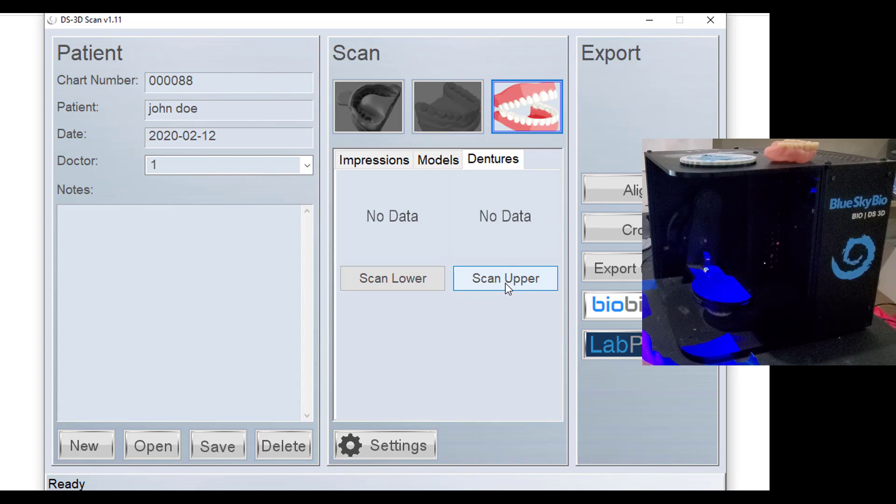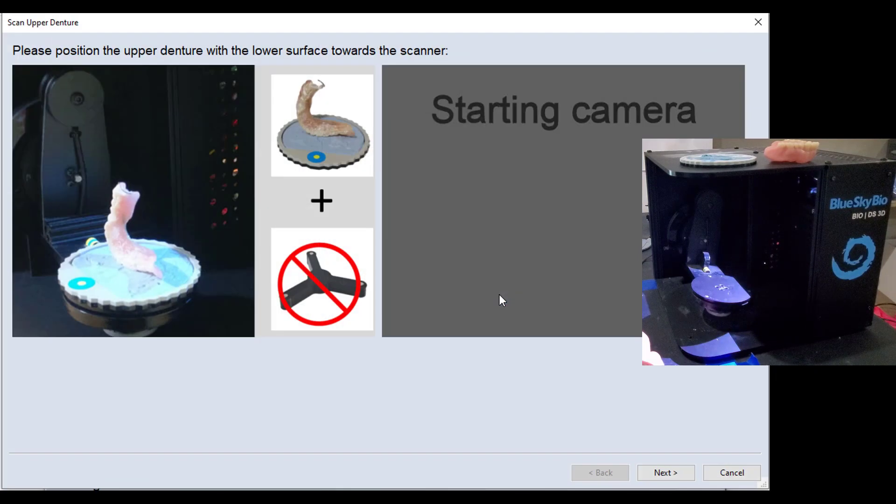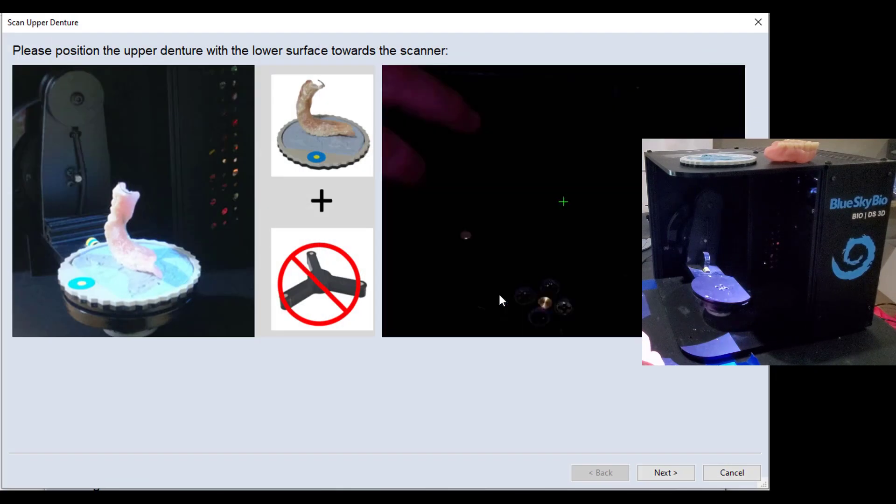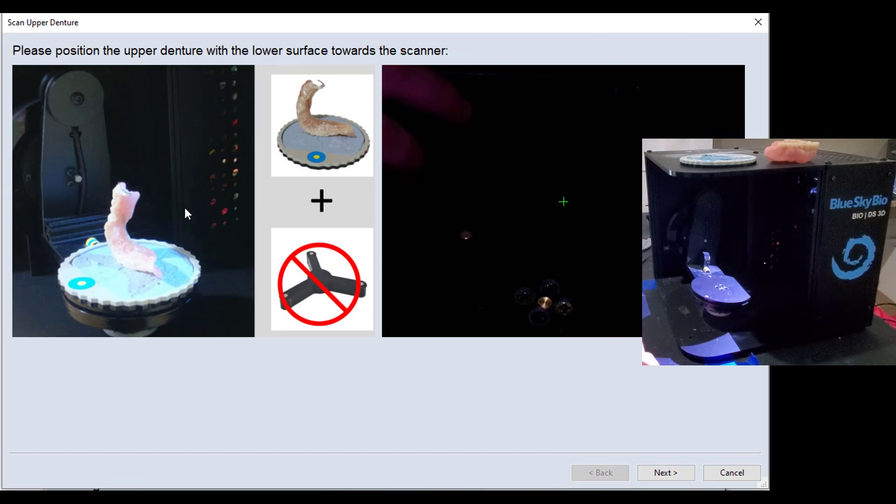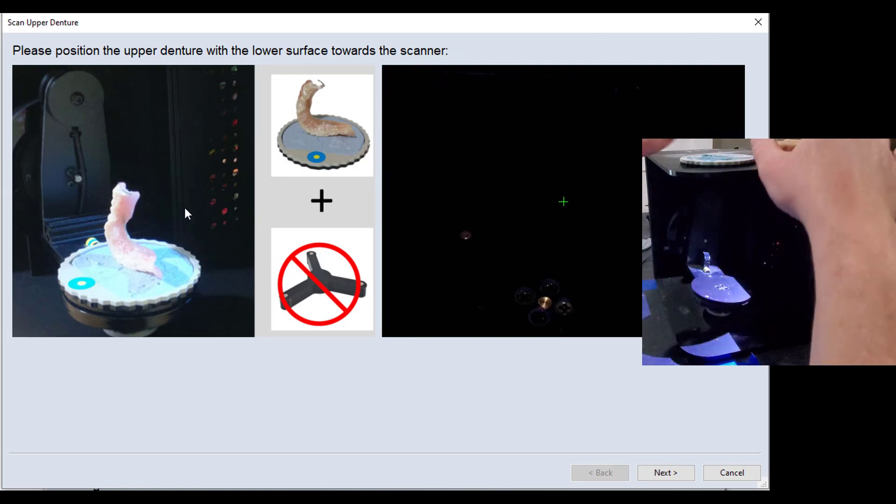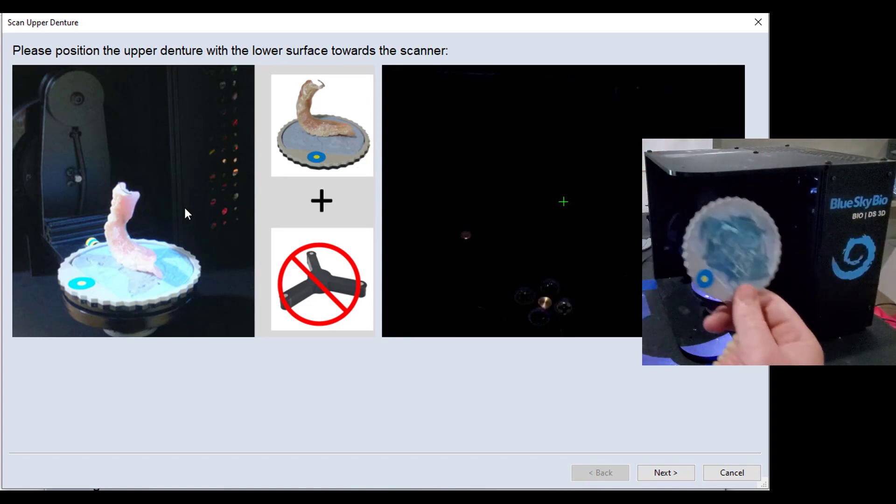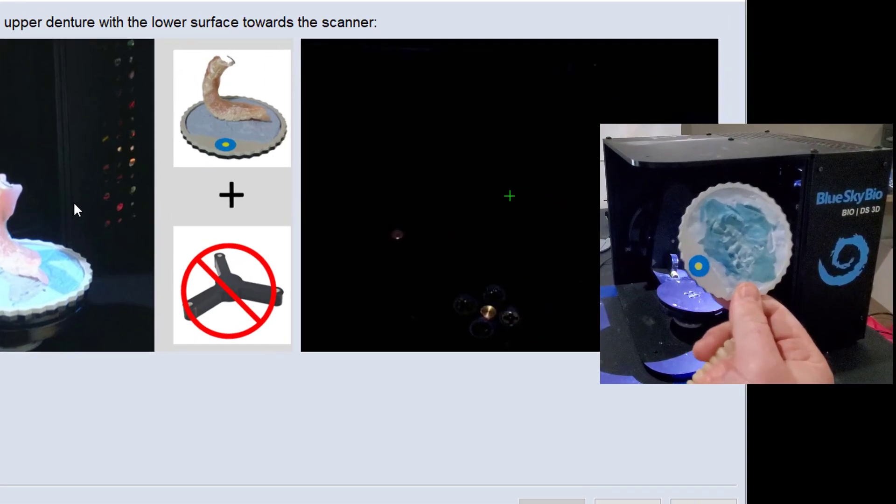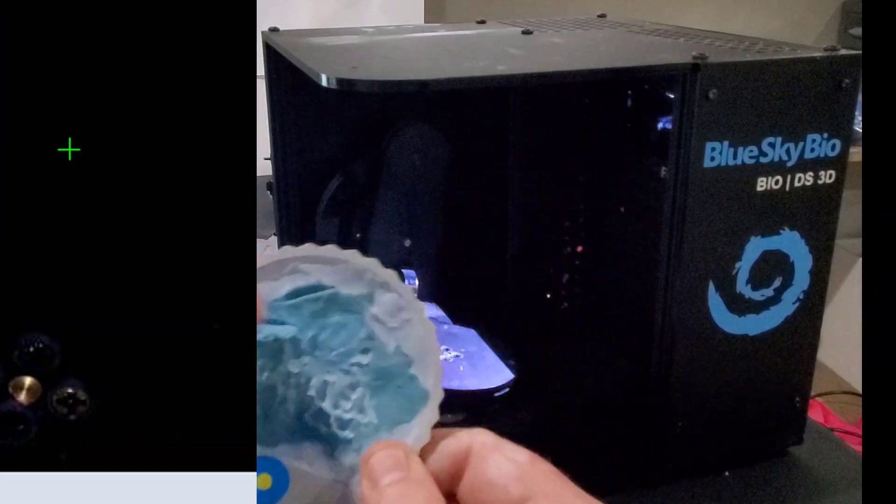So I've got an example upper denture here. Let's go ahead and click scan upper, and the software is going to post some pictures that tell you how to orient this model. So what you'll want to use is just the normal plate that has the tacky material in it.